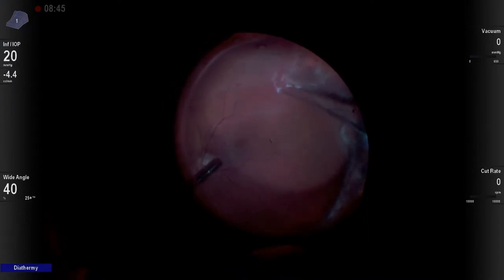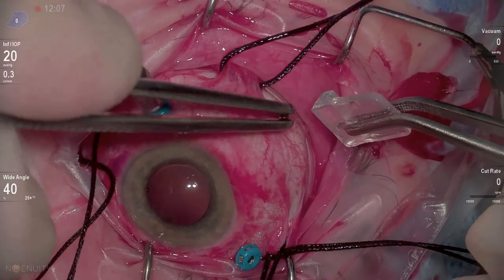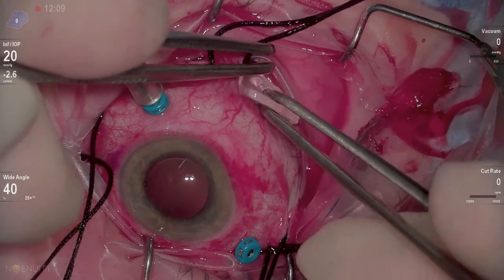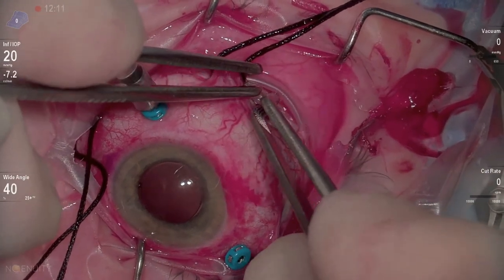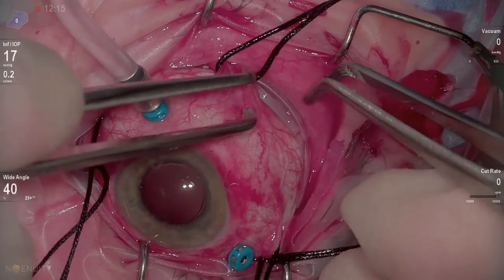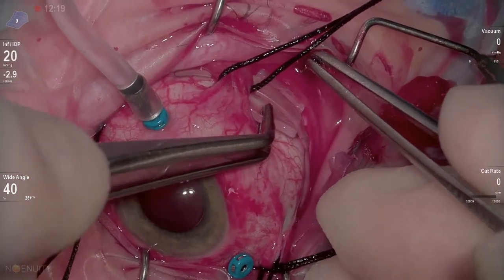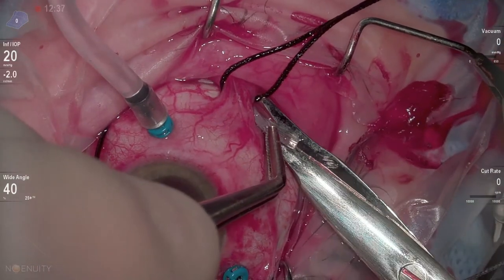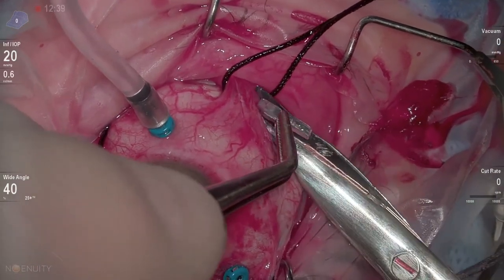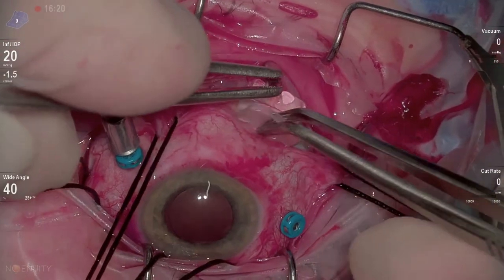In this case, the tear was fairly ragged, had early proliferation, and was fairly posterior, along with being inferior. So I encircled the eye with a 41 band using scleral tunnels and placed a 106 element. I really like this 106 element as a segmental element where I can lock it in place and trim it — no sutures are typically needed, and it holds in place giving really nice imbrication.